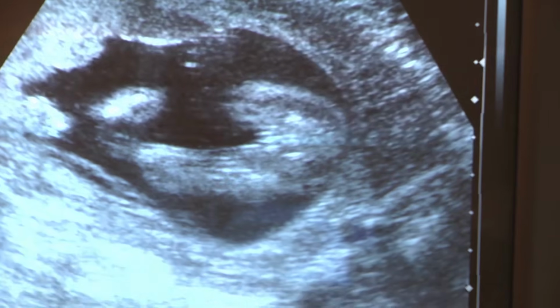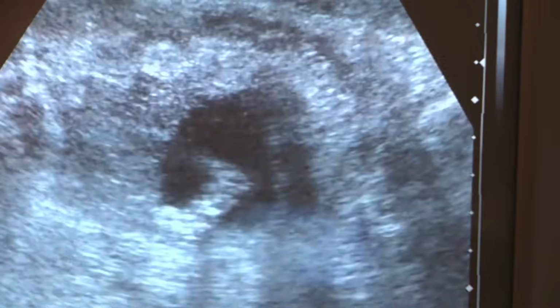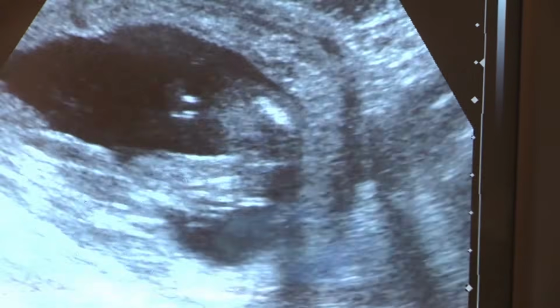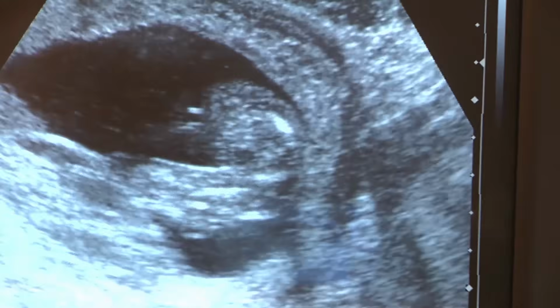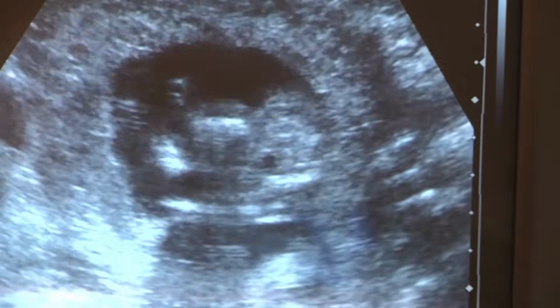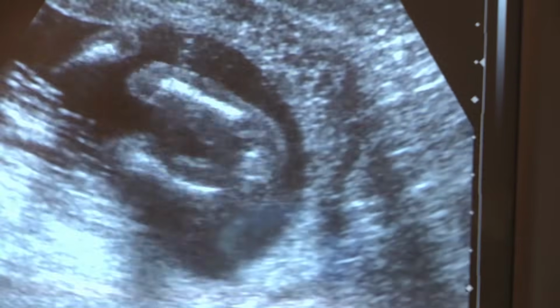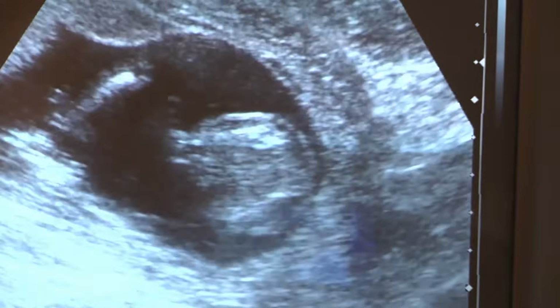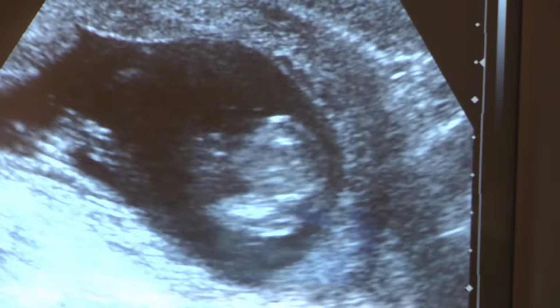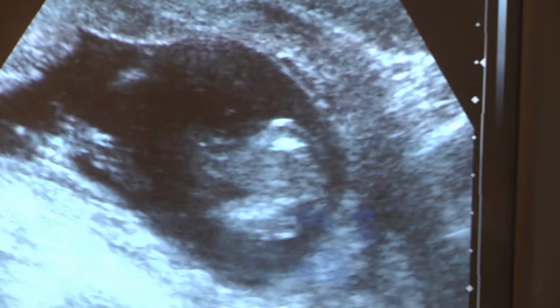But it's only a guess. I couldn't get a better shot because she didn't want me to find out. But you're going to find out next week, right, when you go for your next ultrasound. That's my guess, because I didn't see a turtle stick out either. Congratulations. Thank you so much.